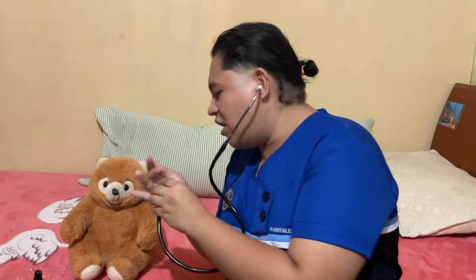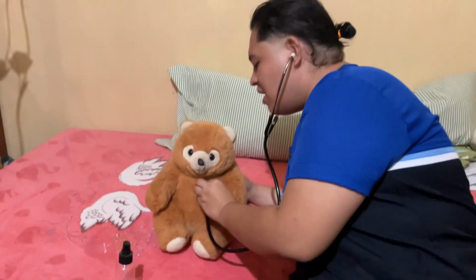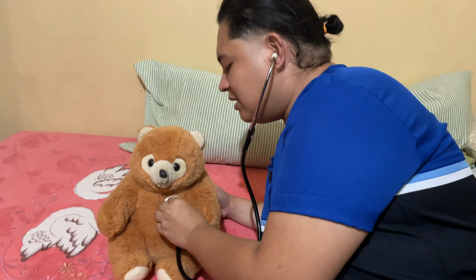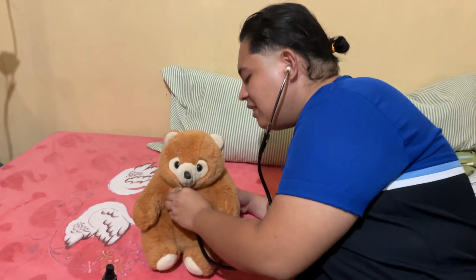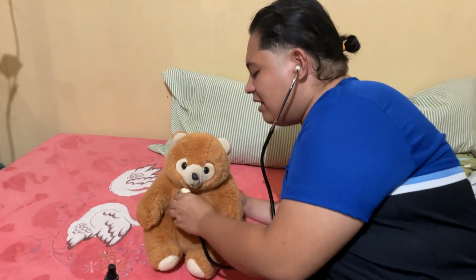So, I will auscultate your chest, sir. Inhale. Then exhale. Inhale. Then exhale. So, normal. Then, give health teachings regarding the medication.